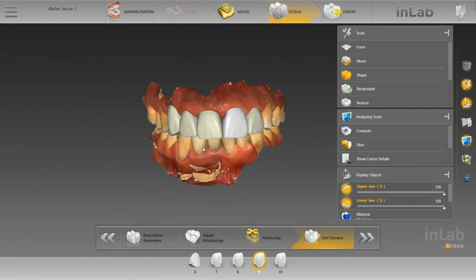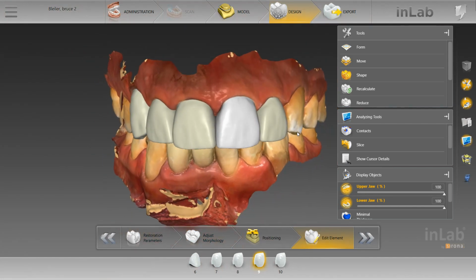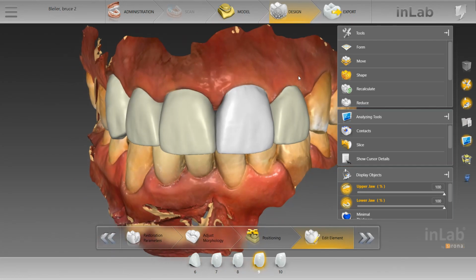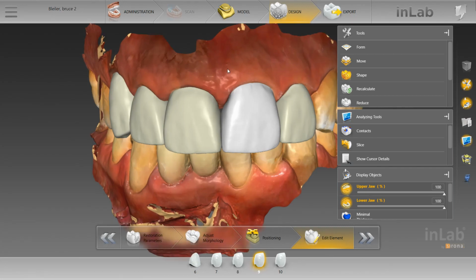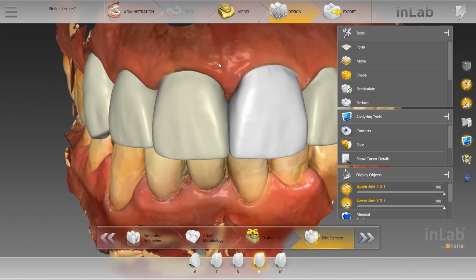So what we're gonna do is, and as you can see, this midline is pretty good. This case was milled and finished in a good amount of time. It didn't take much adjustments after everything was milled.